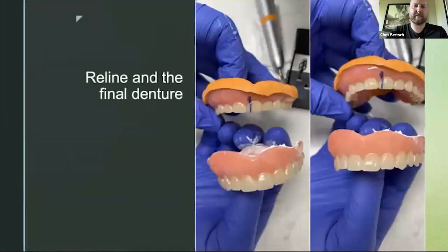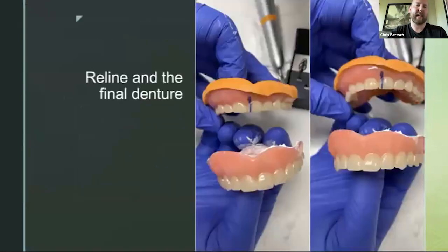The midline was off, and he wanted bigger teeth. In this image you can't really see his teeth too much, so he wanted them to be more visible, which I agree with. All I did was draw the midline in, we did the reline, and then I sent pictures of Arnie to the lab with his denture in, and the bottom denture is the denture that we got back. The point of that is that there are simple ways to correct things that make such a big difference, like the aesthetics and the size and shape of the teeth. You don't need to pick the teeth out yourself.